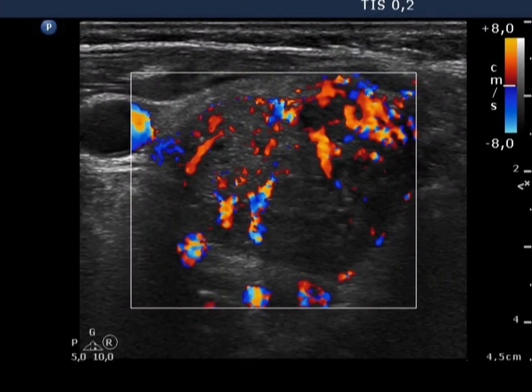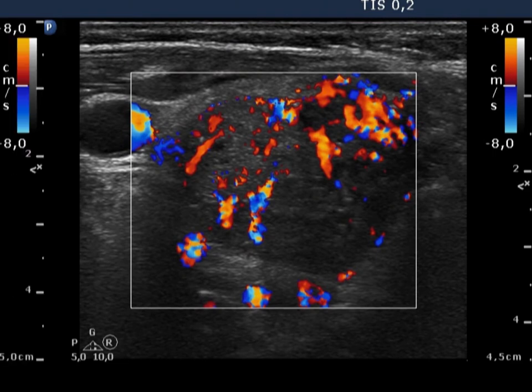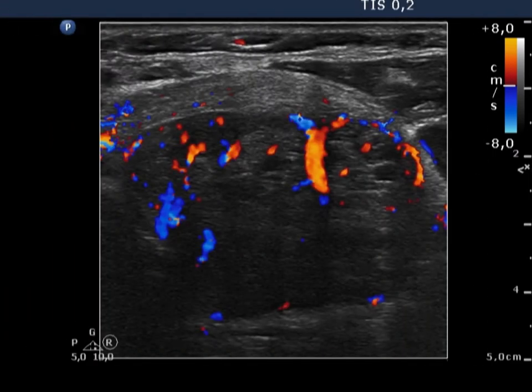Corresponding to the hyperthyroid state, the vascularization is increased in both lobes.